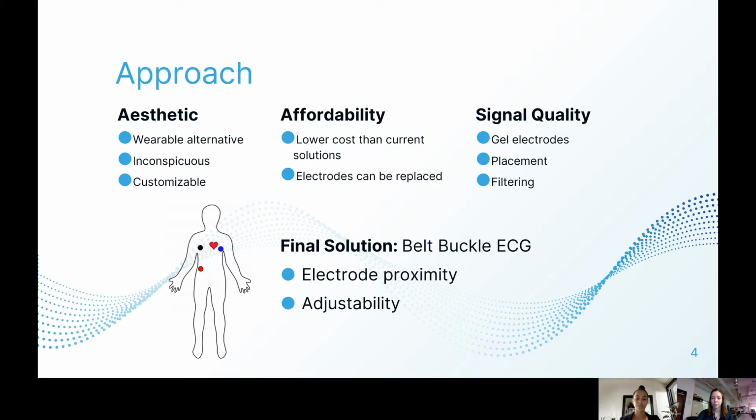Portable ECGs can range from $200 to $500, so while they can be high quality, they also come at a high cost. Apps can be less expensive but require a supportive device like a phone or watch that is capable of handling the software. Even then, the app alone can cost between $80 to $120, and the quality is often subpar due to the distance from the heartbeat.